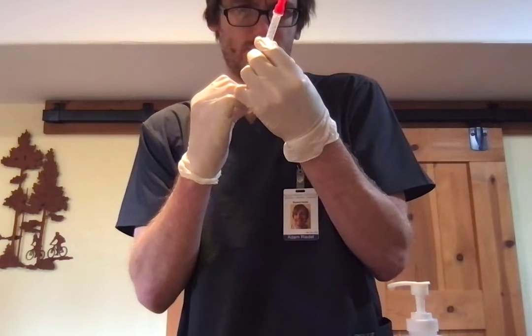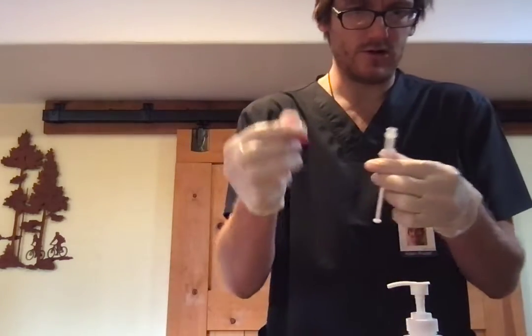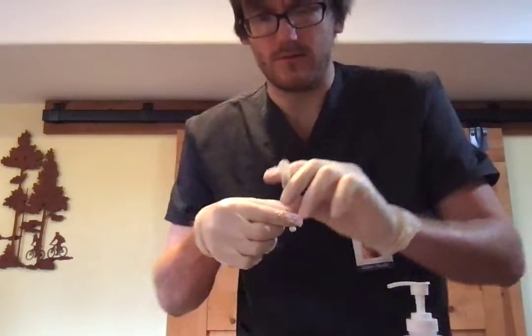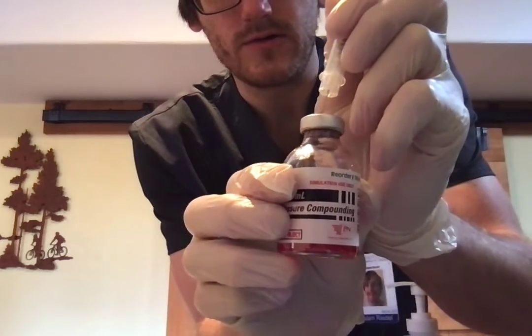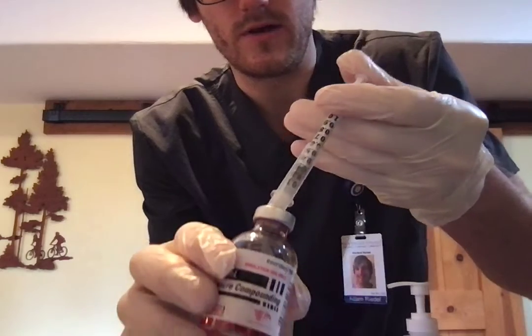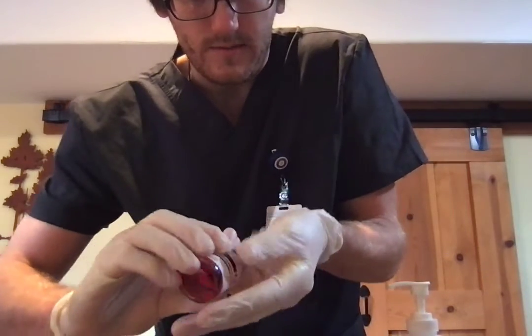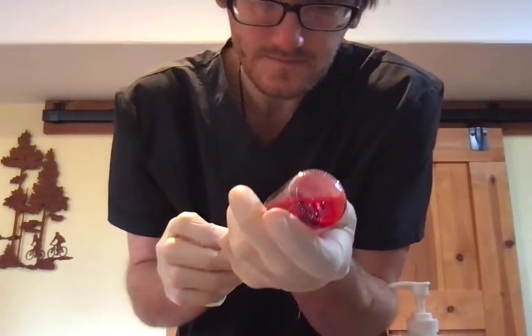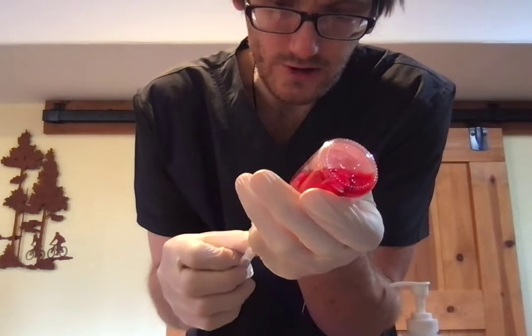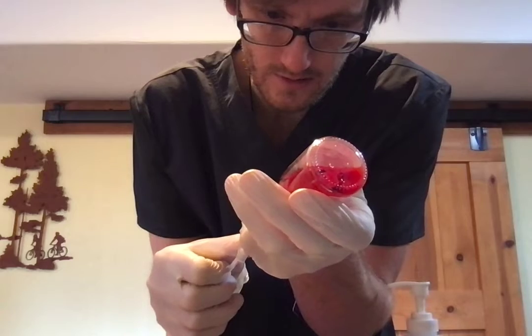So I'm going to inject some air into my syringe here, and I'm going to inject the whole milliliter, and then I'm going to make sure that I got all this on camera this time. Inject my air, and then I'm going to tip this upside down and let pressure help me out here.